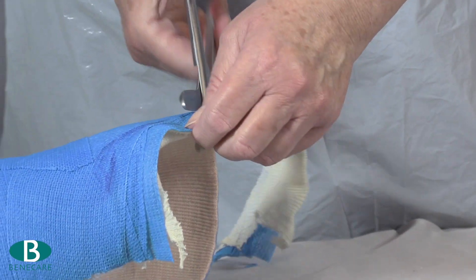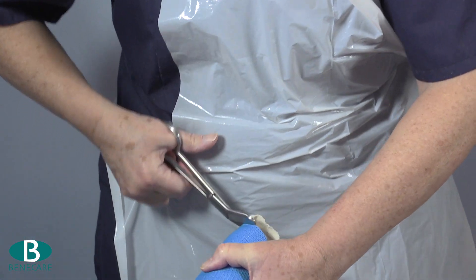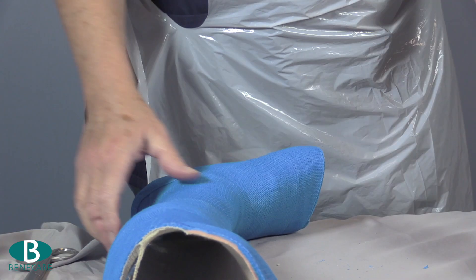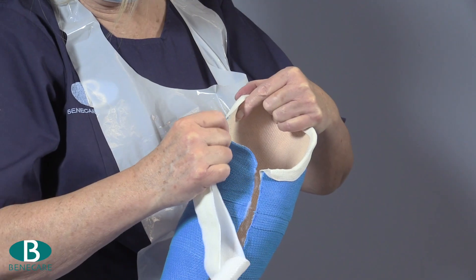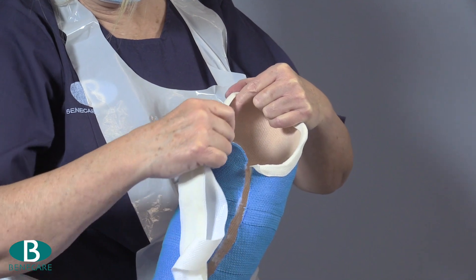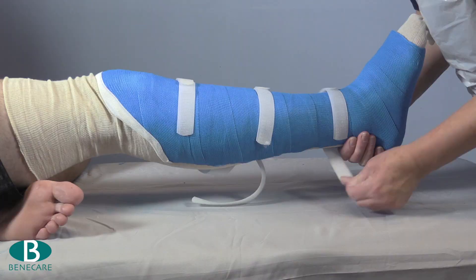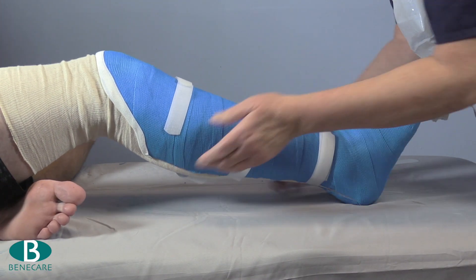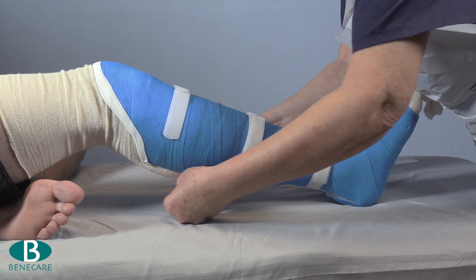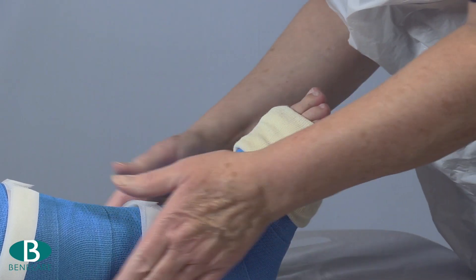Trim the cast at each extremity and then using fleecy web or elasticated strapping, edge the cast. Apply three pieces of adhesive hook and a non-adhesive loop wrapped circumferentially along the anterior border of the cast.